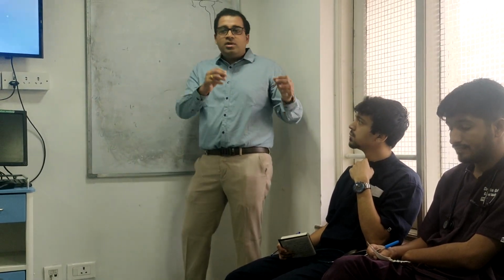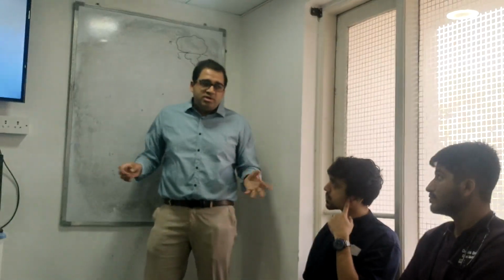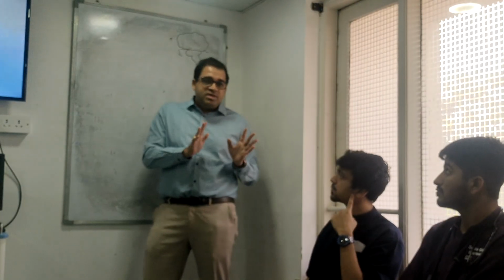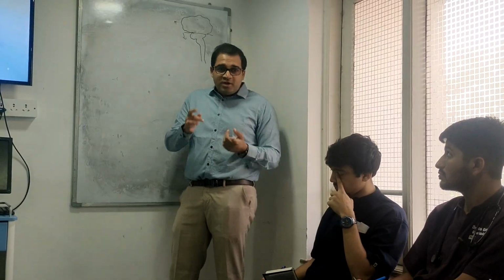But at least तुम्हारा meropenem, piptaz, ceftazidime, ये सब के लिए this is very standard and it's automated. It's not done by dilution anymore. You can confirm it when you have any discrepancies. तुम्हारा रिपोर्ट दिखा रहा है कि meropenem resistant है और piptaz sensitive है for an E. coli, it's impossible. Then you will reconfirm it by dilution.